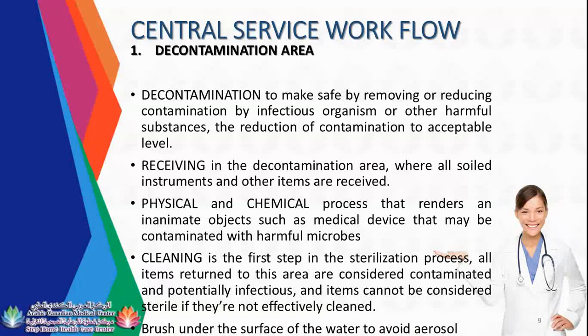All items returned to this area are considered contaminated and potentially infectious, and items cannot be considered sterile if they are not effectively cleaned. Brush under the surface of the water to avoid aerosol. Usually in your decontamination area, there are two sinks. Your first sink will be your brushing area. You need to fill it with water, and then brush the instruments under the surface of the water to avoid aerosol.